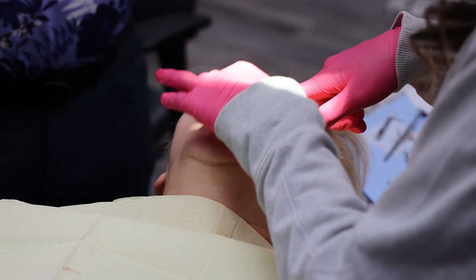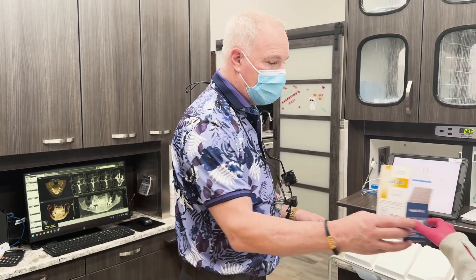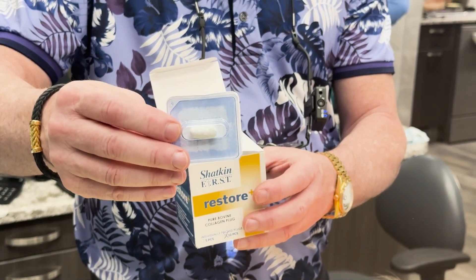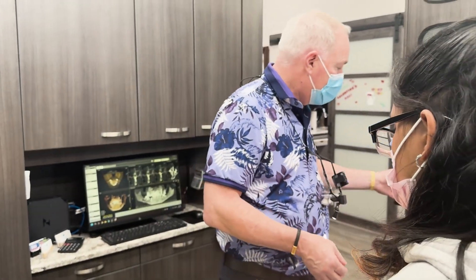We successfully extracted tooth number 12 and 14. We placed three implants: one mono at number 12 — that was a 3.75 by 13 — and two 2.5 by 11s at number 14. We packed the Restore Plus bovine collagen plug in the sockets around the implants, and then put some hemostatic gauze, the Hemostep product, on top to act as a membrane and a barrier. We're going to now make temporary crowns, and she'll have those for about four or five weeks. We'll have her back to take impressions for the permanent crowns once that all heals.